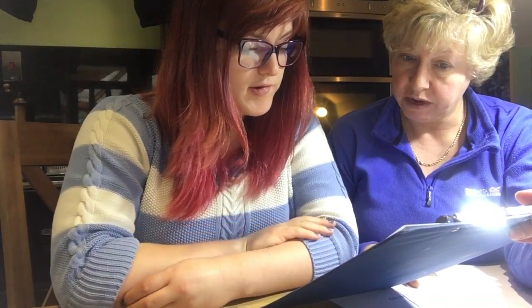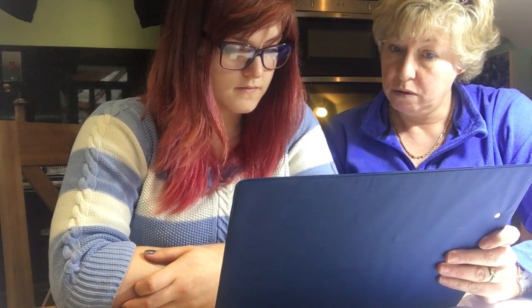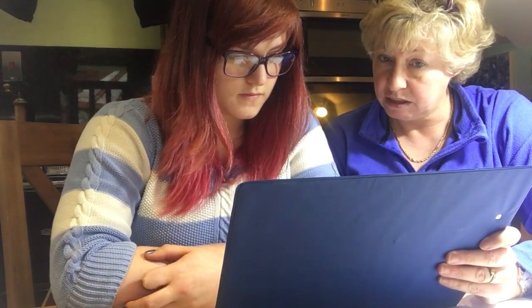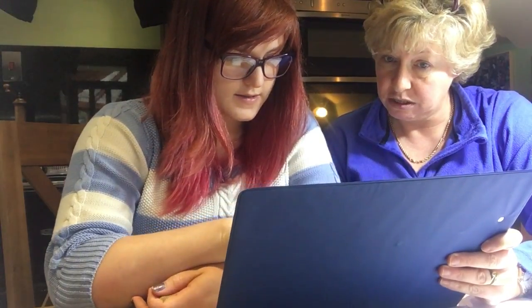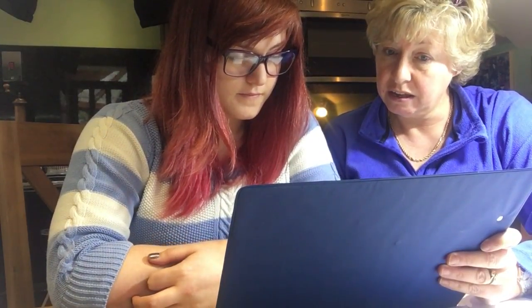Okay, that's fine. I'm going to flick it over through 90 degrees now, so it's on the horizontal. Now, can you tell me, again focusing on that central cross in the middle, if the lines are straight for you or if there are any wiggly deviations? Again, here there's a slight wiggly curve, but I can see it. Okay, that's great then.